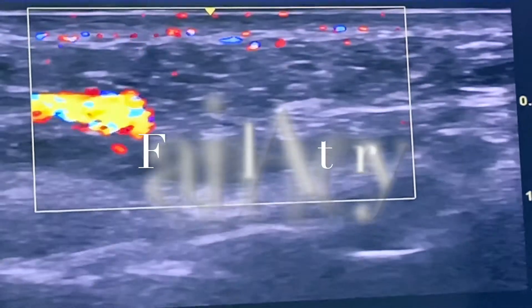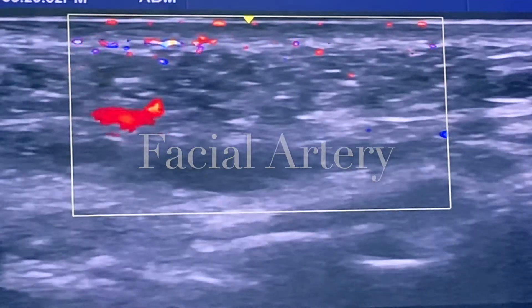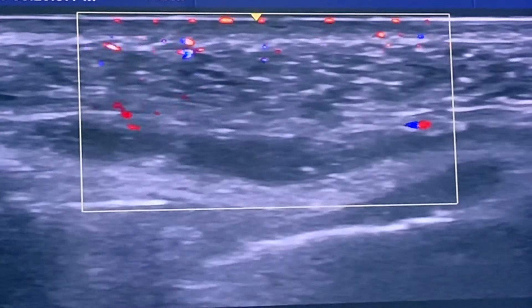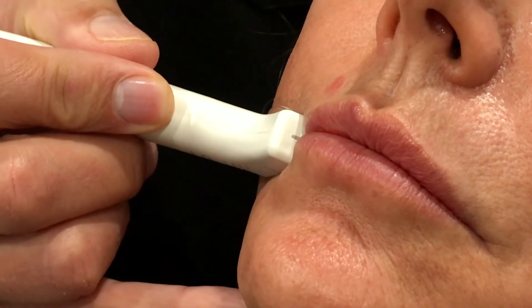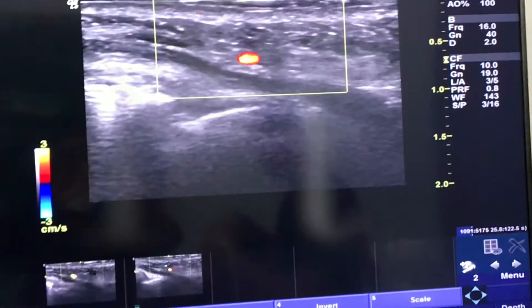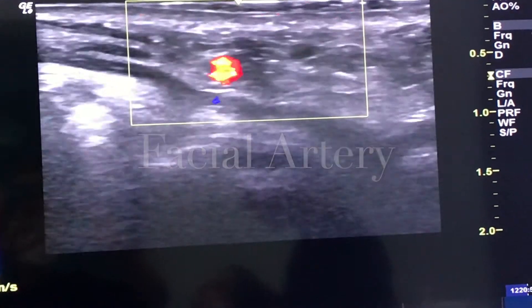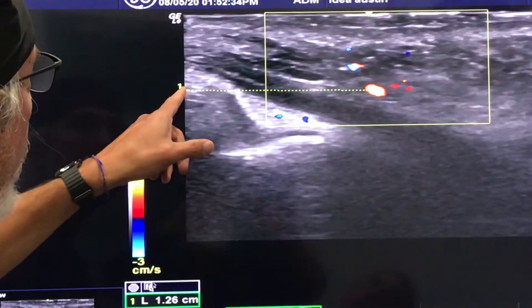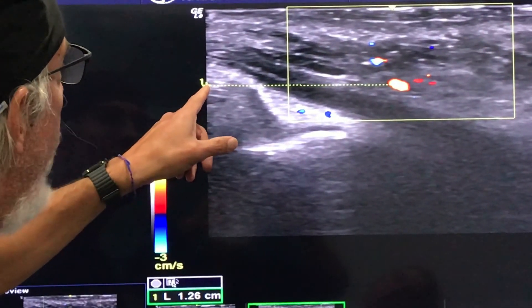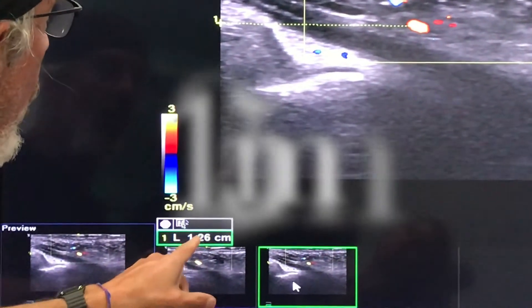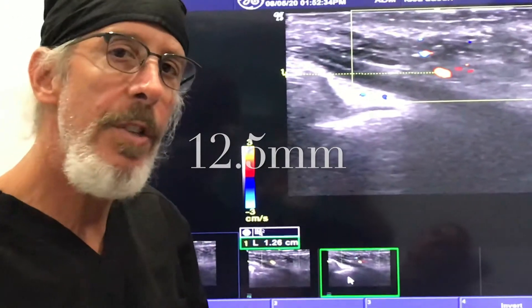Right now what we're looking at is the facial artery around the takeoff of the superior labial and inferior labial arteries. This is an interesting view — taking the probe at the lateral commissure of the oral cavity to see where the facial artery is from that point. When I measure from the medial aspect of the probe, set on her lateral commissure, to the facial artery, I get 1.26 centimeters, or about 12 and a half millimeters, which is about right — between 12 and 15 millimeters from the oral commissure.